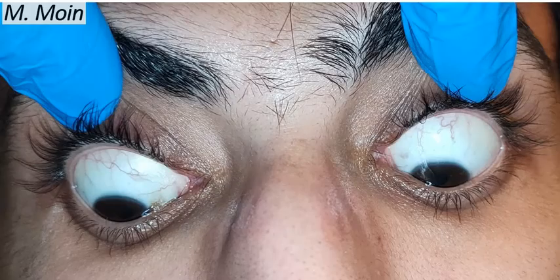On retinoscopy you will see a scissoring reflex, and the oil droplet sign can be seen on direct ophthalmoscopy. This patient did not have extreme thinning of the central cornea, which we will confirm on topography and pachymetry. In advanced disease, fluid can track through the cone into the stroma — a painful condition called acute hydrops that leads to scarring. The cup-to-disc ratio is normal at 0.3. Also evert the lid to check for giant papillary conjunctivitis, as keratoconus is associated with GPC.